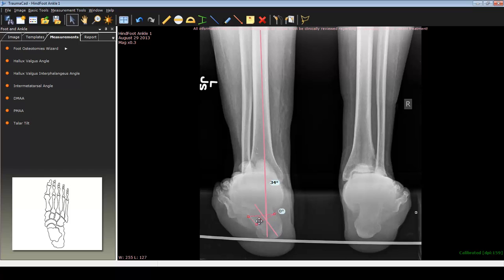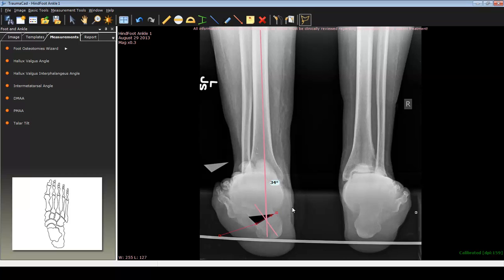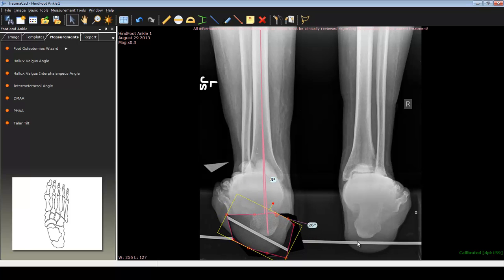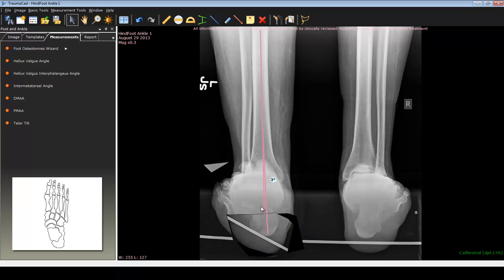So if we remove that wedge, we are left with a gap within the bony architecture. Now we can rotate this bony fragment along the closing wedge defect to correct our deformity. If we select our fragment and use the superior aspect of that bone, rotating along this hinge point, we will see that these lines tend to get more parallel as we make the closing wedge. However, they do not line up exactly where they should because the long axis of the calcaneus is always about a centimeter to a centimeter and a half lateral to the long axis of the tibia. Since we did not do our correction exactly at the apex of that deformity, there is a translational component.